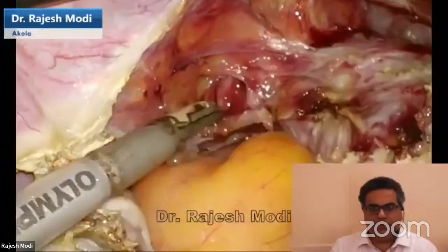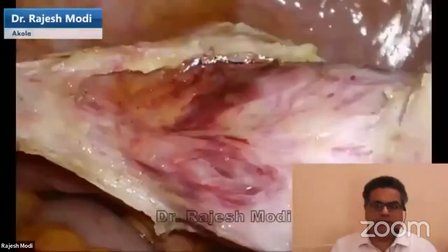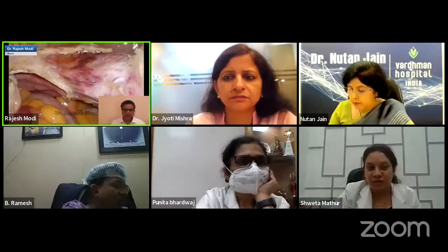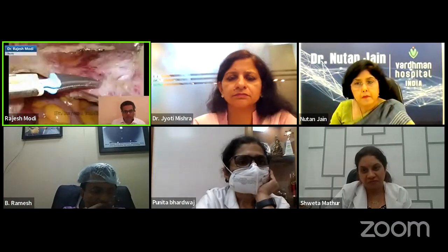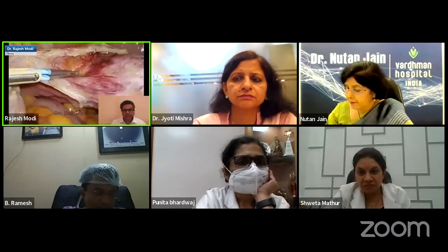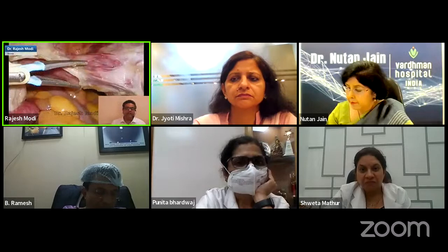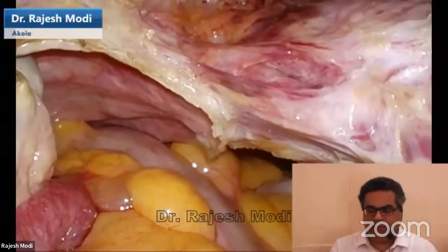Now, how do you really know this? Do you need to see the peristalsis of the ureter? Not really. Once you understand the pathology, the physiology, the anatomy, and you know where the ureter is in conjunction with the uterine, you really need to stop looking for the ureter in a hysterectomy. It's more in the mind and the head rather than the actual problem.